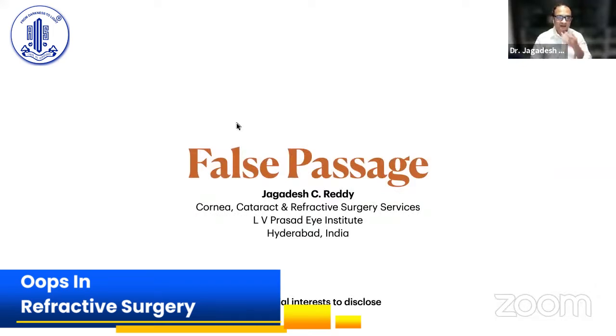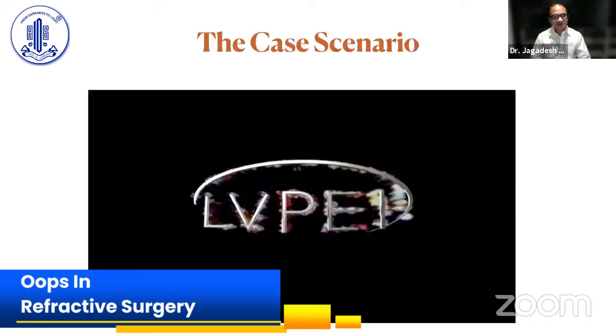Okay, so this was titled as false passage for the presentation. I would label it more as a missed passage during a SMILE procedure. This is a video that we have presented a few times in different conferences. I'll be taking you through this case.